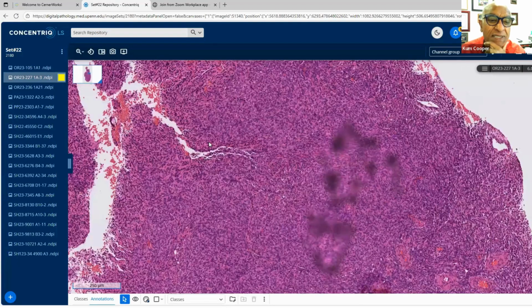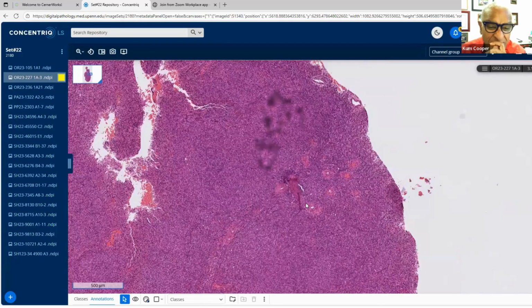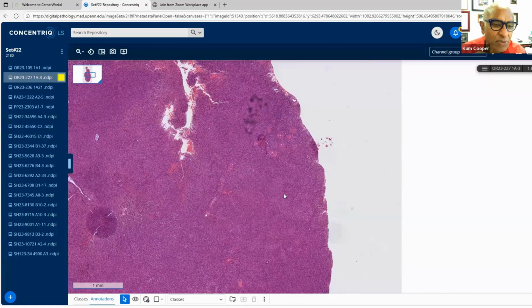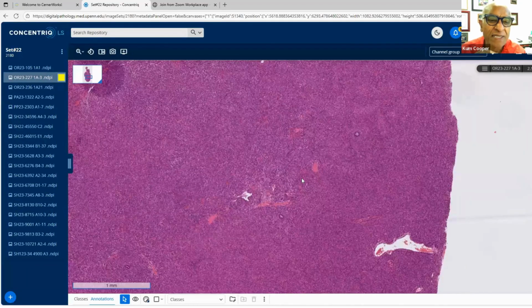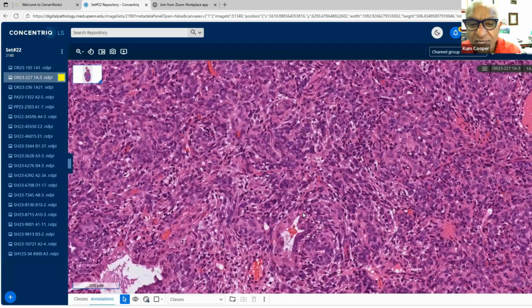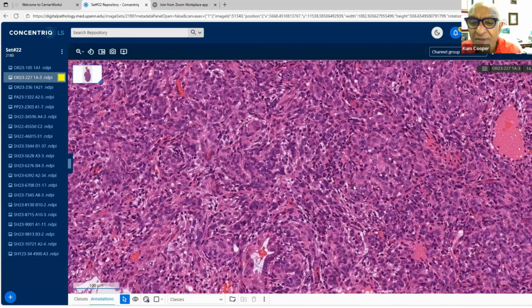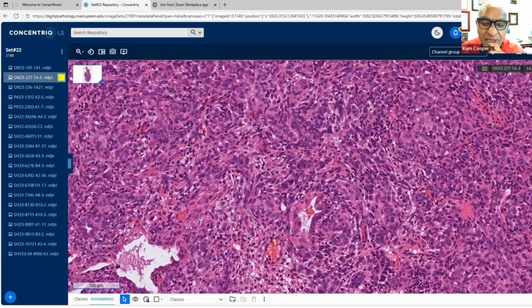There's a nice little nest. And it's subtle because the tumor itself is quite cellular, but you can appreciate different patterns in different areas. In some areas, I'm trying to find you a glandular structure. That's a vessel there. Little nest is another nest, and little cords as well.